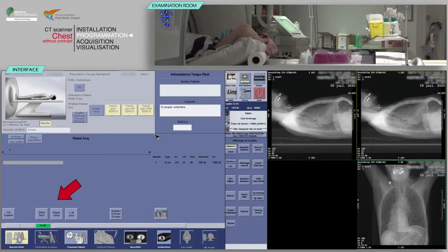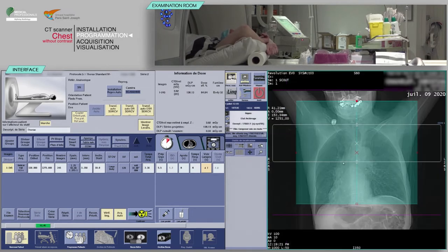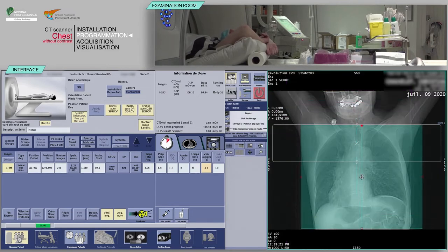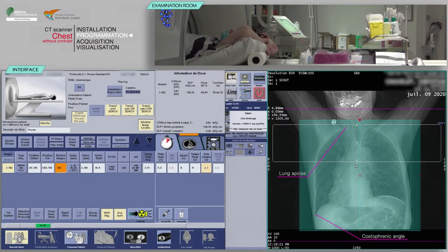Click on next series. Place your slices box in such a way as to cover the chest from the lung apices to the costophrenic angles on the AP scout view.